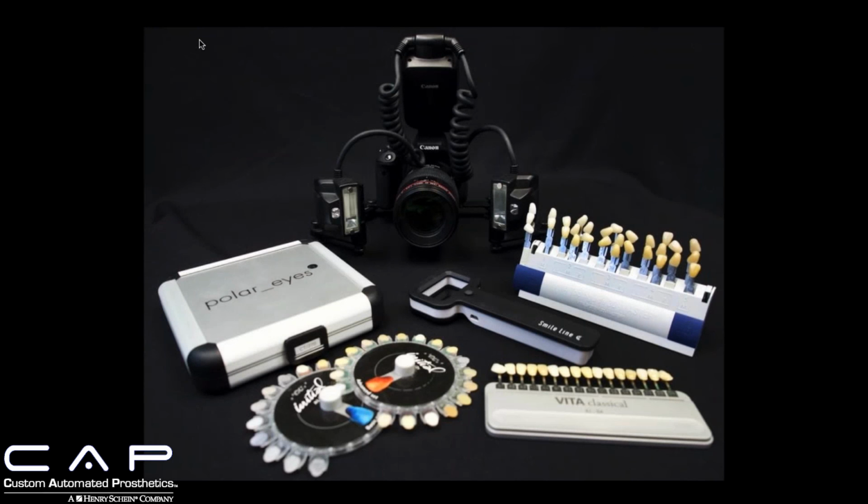So here is my basic setup for shade taking in photography. We have the classic Vita shade guide, which we'll be talking about in a little while, the 3D Master shade guide, some of my ceramic shade tabs that match the ceramic that I use, which is GC Initial.